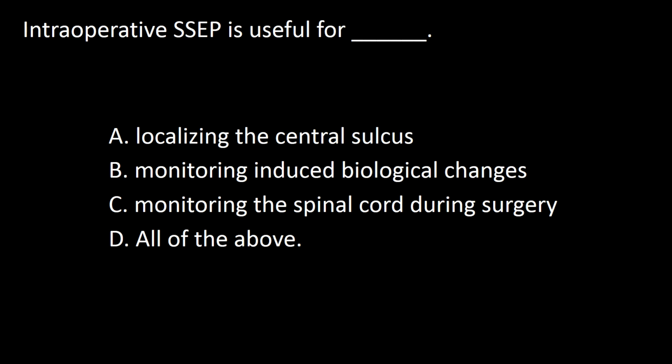The first question is, intraoperative somatosensory evoked potentials are used for: A. Localizing the central sulcus, B. Monitoring induced biological changes, C. Monitoring the spinal cord during surgery, D. All of the above.